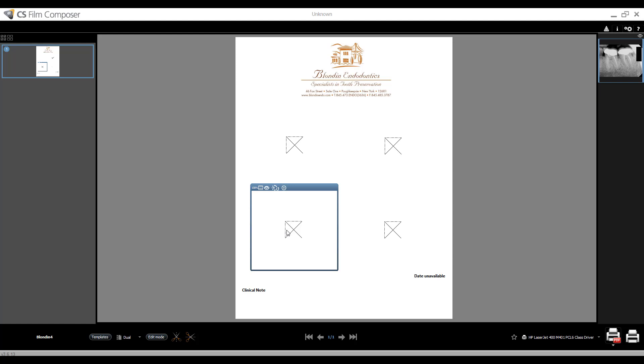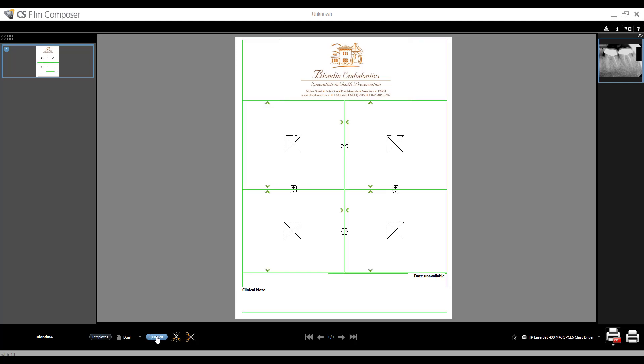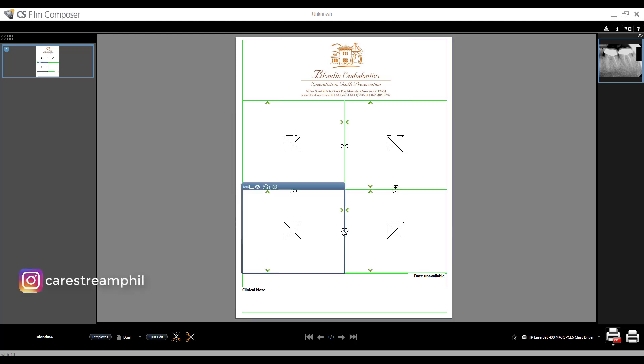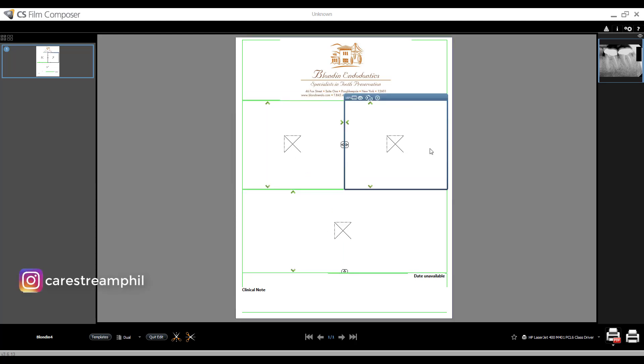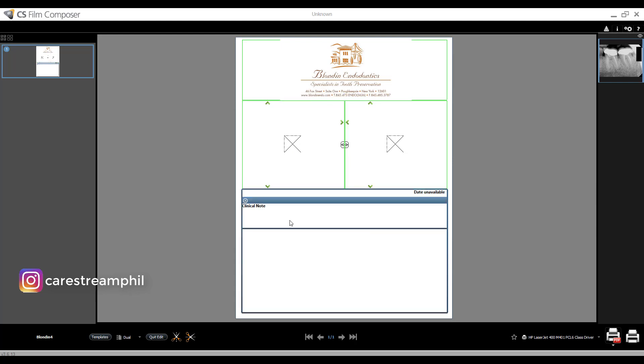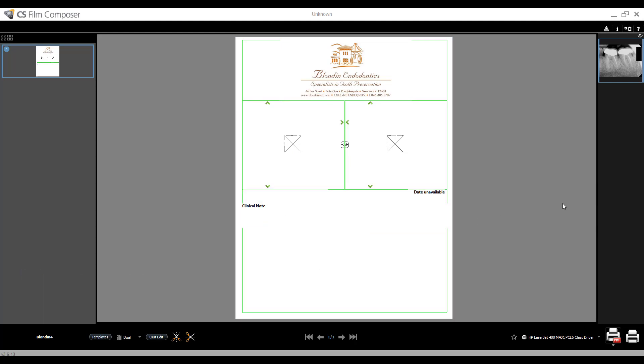But let's say I only want two images. So what I can do is go into edit mode. And you can see these arrows. So if I want only two images, depending on which orientation, let's say I want two images side by side like this, I'm actually just getting rid of these other boxes. So now I have only two images with this custom clinical note that I've added as well.